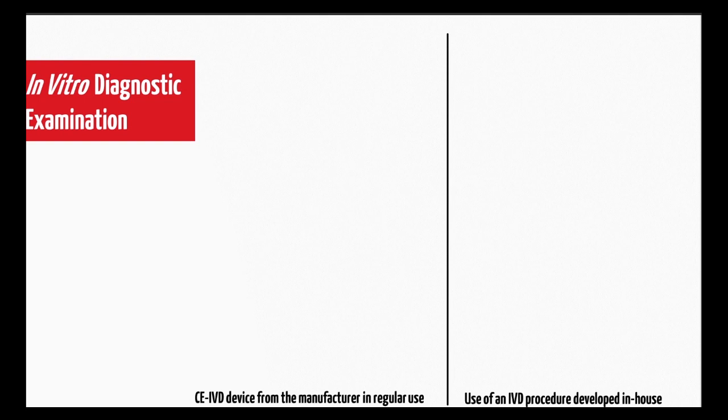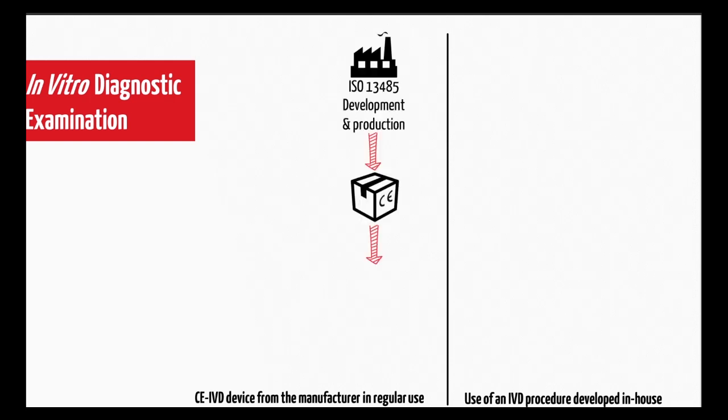So let us see what is the difference if a laboratory is using CE IVD devices from the manufacturer in regular use versus the use of in-house developed tests or in-house devices.